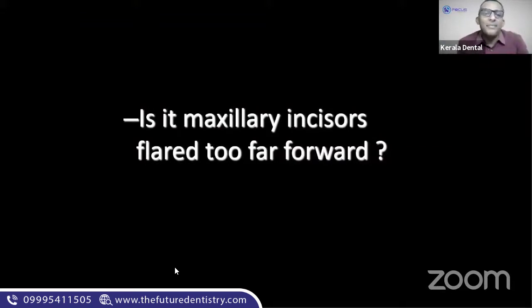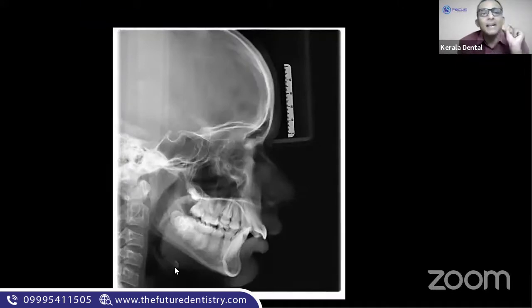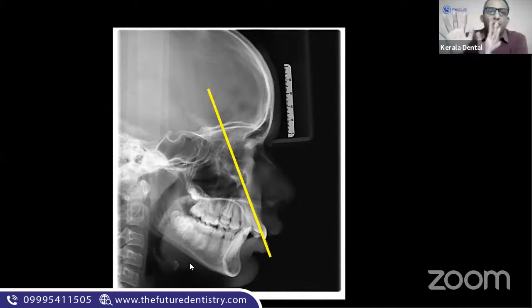Take a lateral ceph. In the lateral ceph, find out, now look at my mouse point here, the incisal tip and the root tip, and draw a line up there. Is it very difficult, guys? Forget cephalometrics for some time and listen to me.